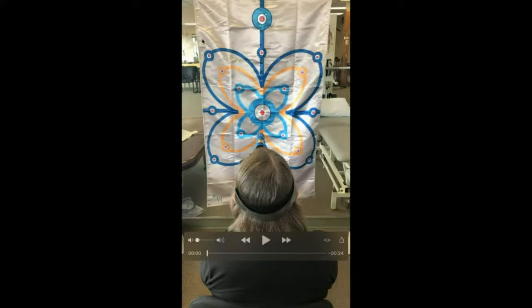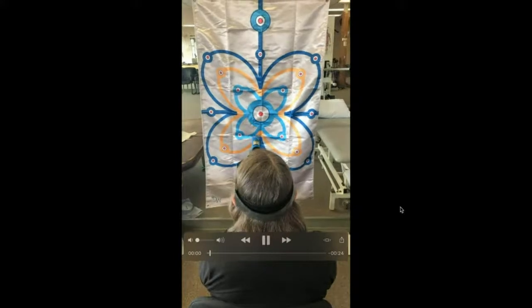So her right eye tends to be dominated forward when she's in that position, versus toward the right, which would be left eye dominated in that position. So nose to the right is much less excursion than to the left. So let's take a look at those two things again as we roll this through.